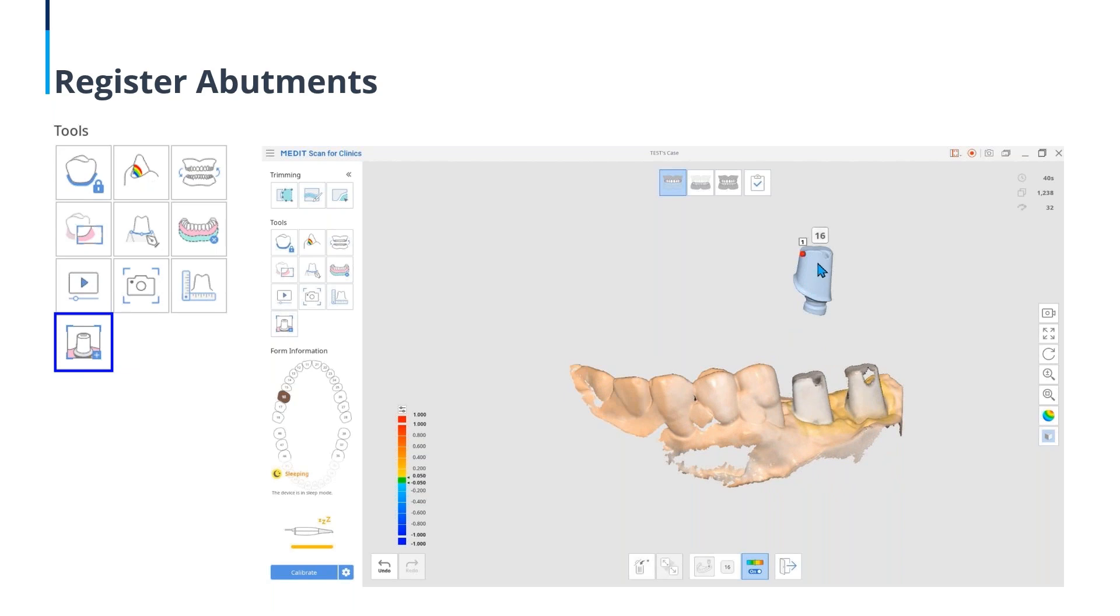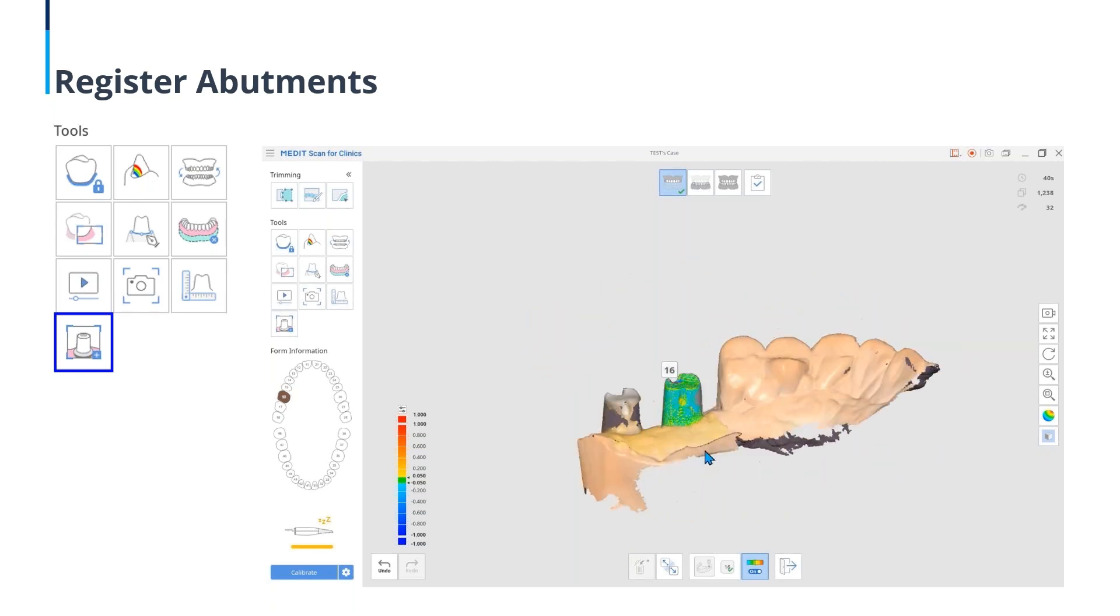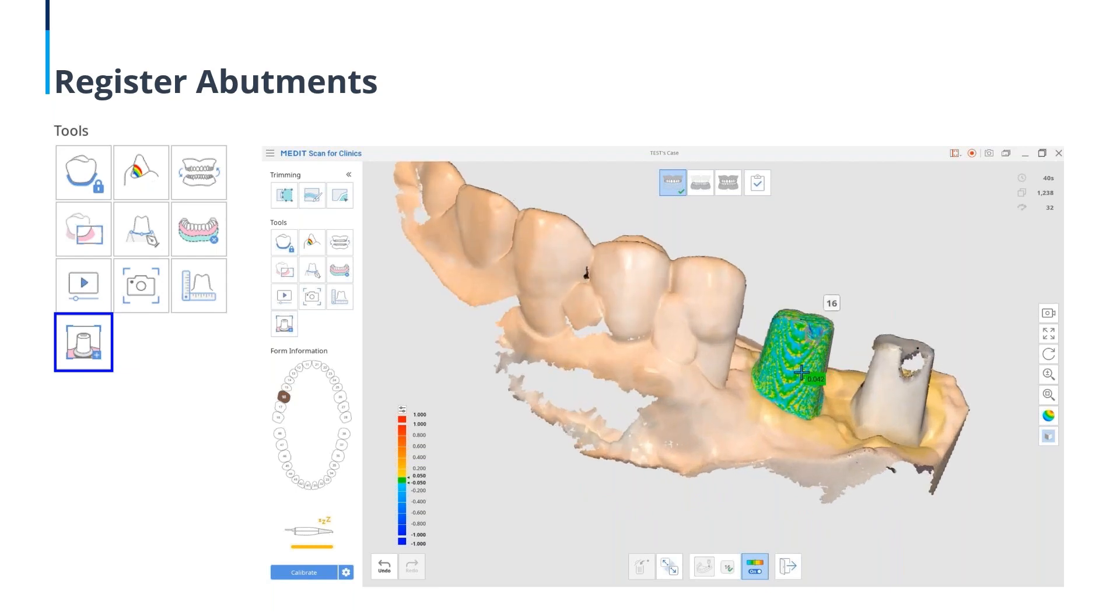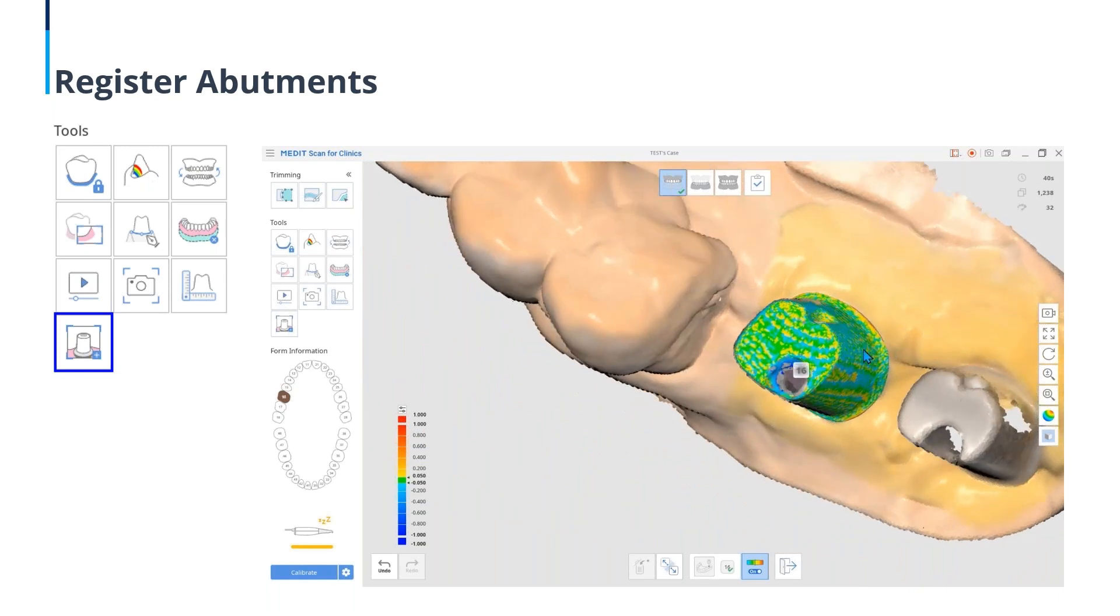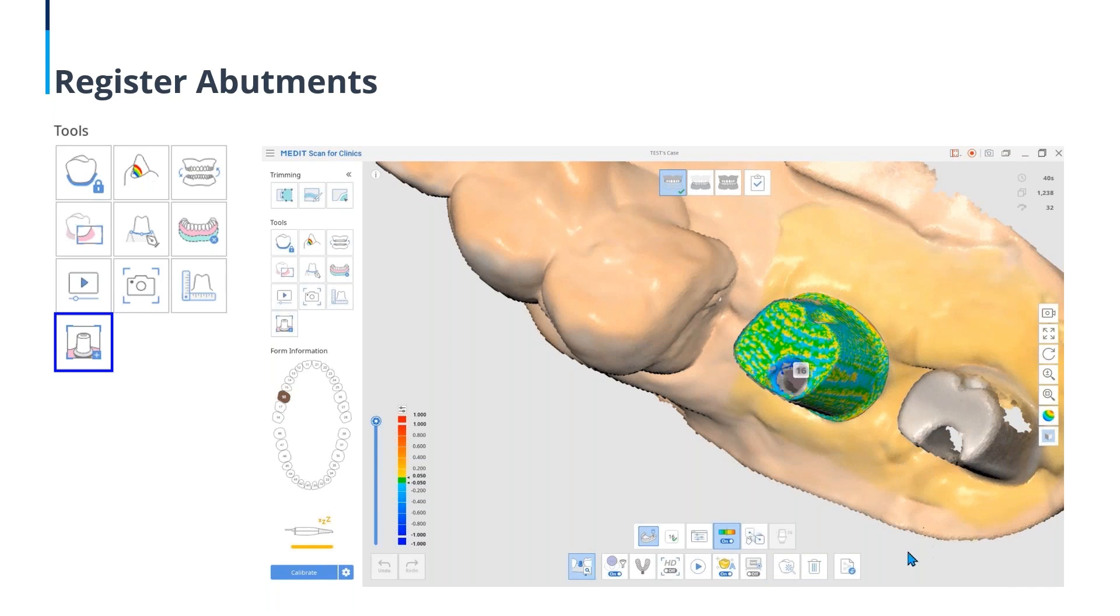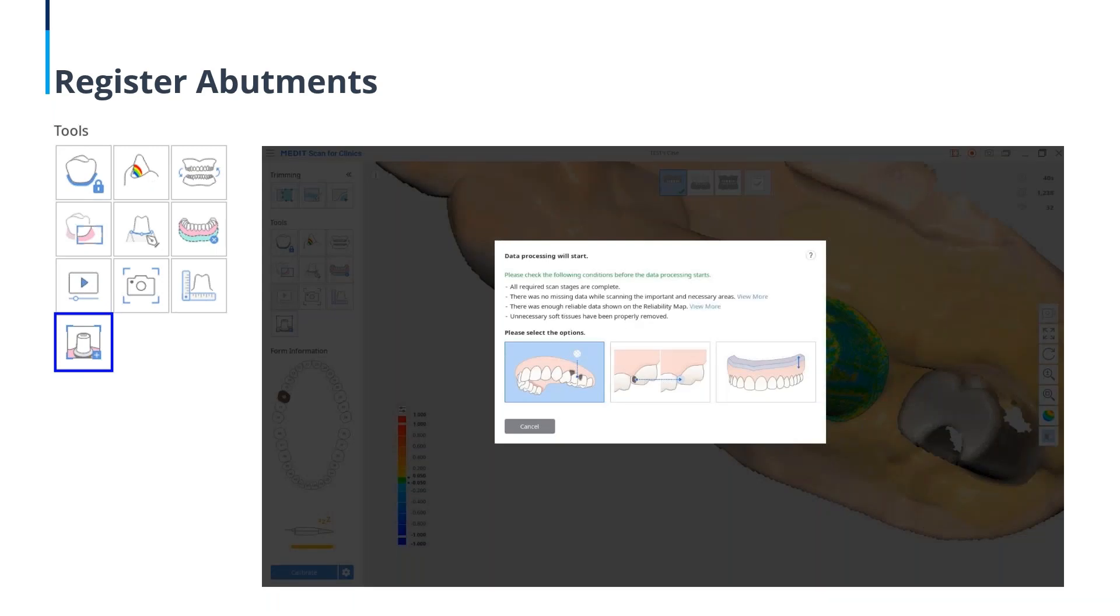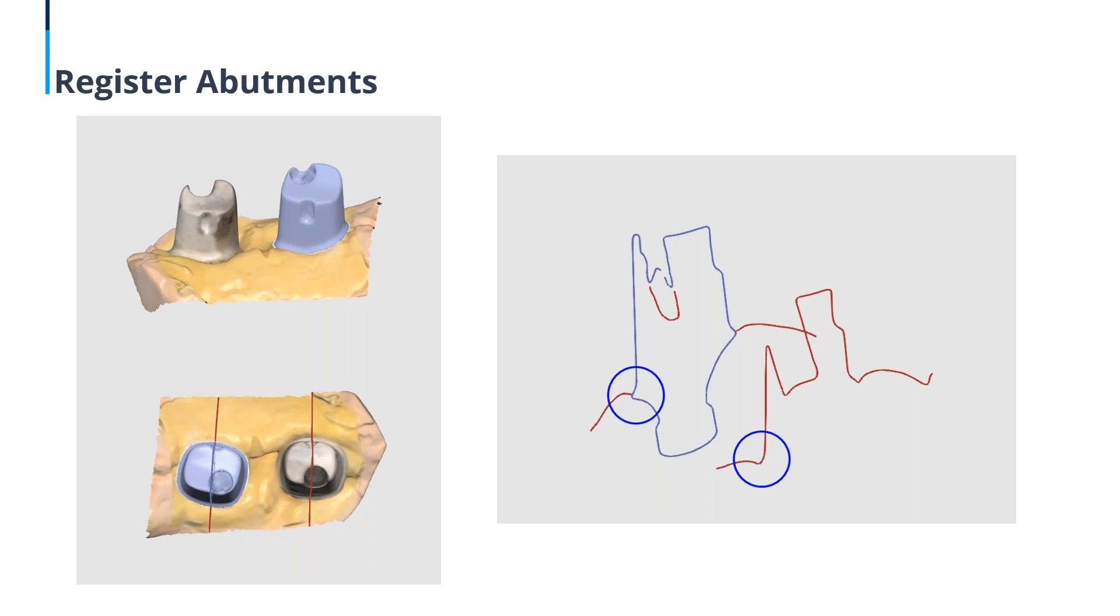It's going to pull that abutment into the screen here with our scan of the patient's mouth. Let's go ahead and align this with the three-point alignment, selecting on the implant library or the abutment library and the abutment in the patient's mouth. And there you go. You can see where it's merged. Let's just go ahead and inspect this really quickly. You can see by the coloration there the closeness of the merging. So you can see how simple that is. And then at that point, once you're satisfied with the abutment scan and the merging, you can go ahead and click complete at the top of the screen. Using the library, you can get more accurate and comfortable data in areas that are difficult to scan, such as subgingival margins or areas that are too close to the adjacent teeth. By using the library and doing it this way, you're going to be able to pick up information in more difficult areas to scan.